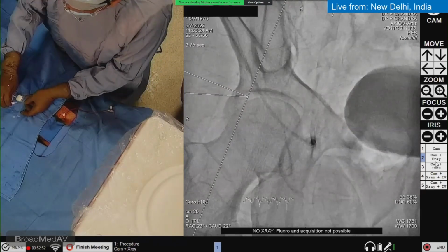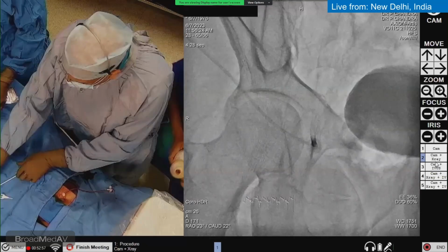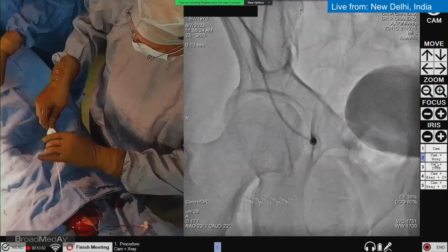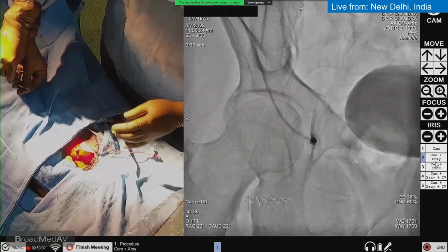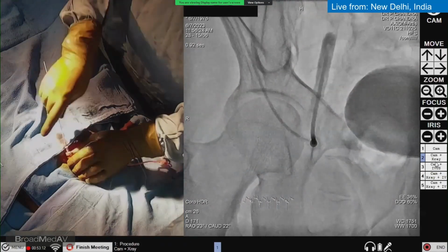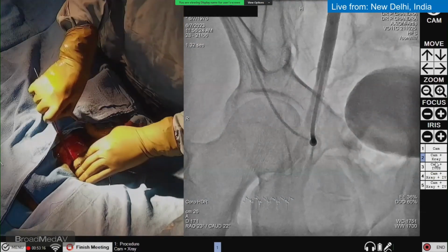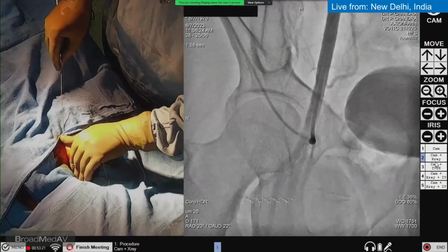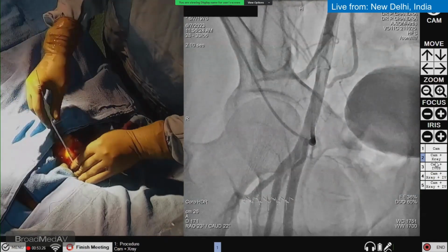So we'll now angioseal it. Okay. So here it goes. This is an 8 French angioseal.